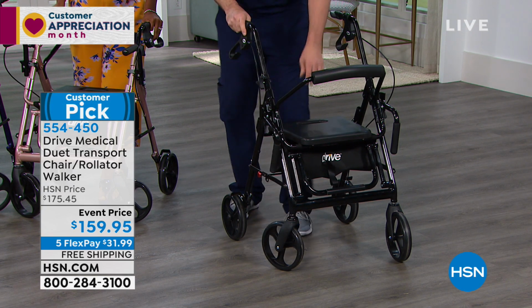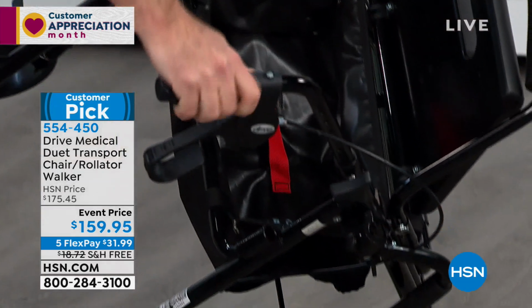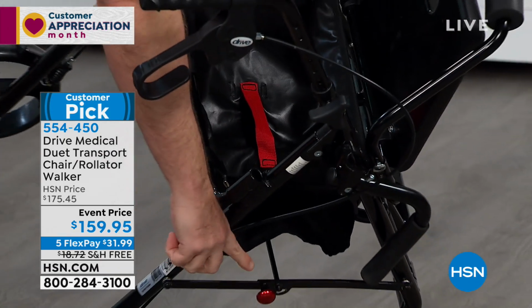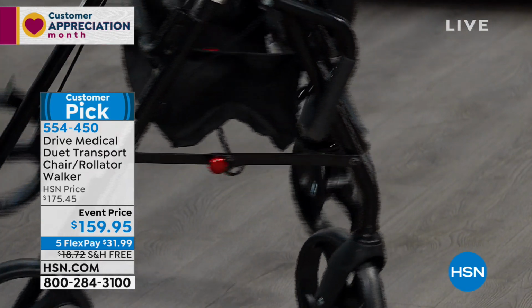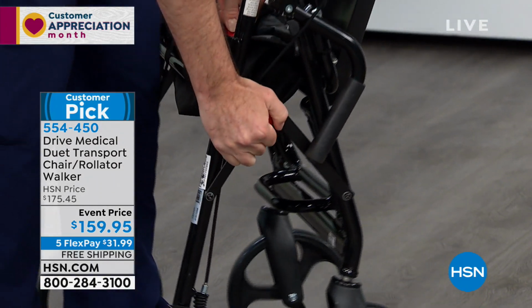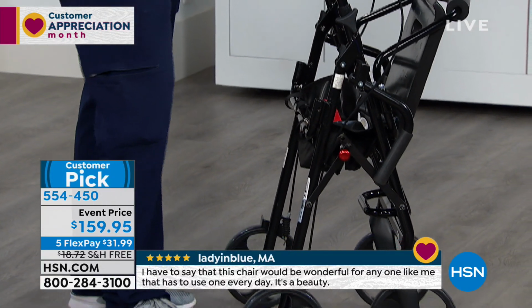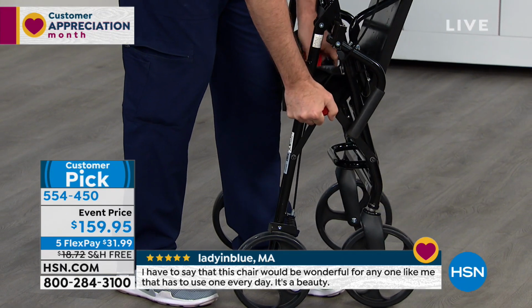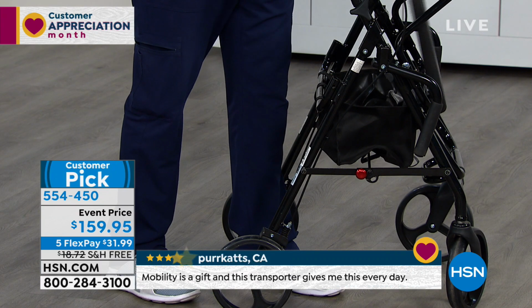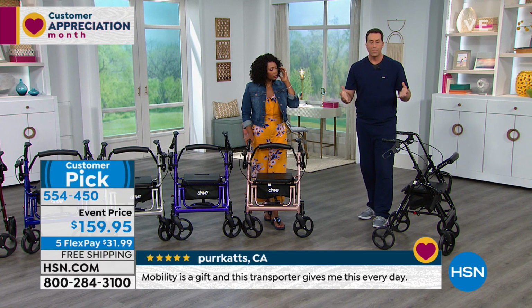So if I lock my brakes, if I open this seat here, take a look inside, if I can get the right angle so you can see it at home. So here's that red handle that I have inside, and I also have that red pin that you saw earlier in the video. So I'm gonna go ahead and just take a little tug on that handle and pull this safety pin, and you see here, it's actually gonna lock in a folded position. So I can't open that unless I pull this pin back out. Then I can't reverse the process unless I pull that pin. Okay. So it's going to lock in the folded position. It's going to lock in the open position.